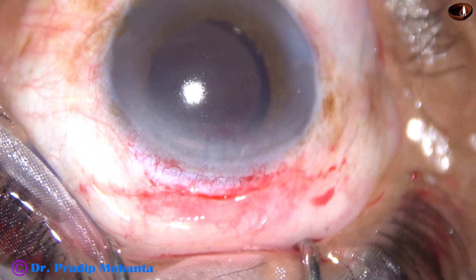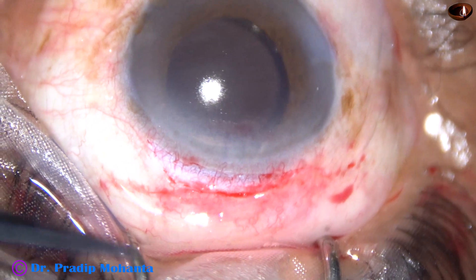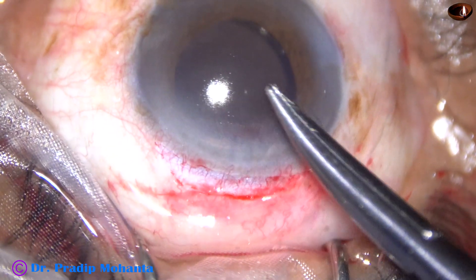So, this is your releasable suture. Very easy to remove when the patient is sitting on the slit lamp.